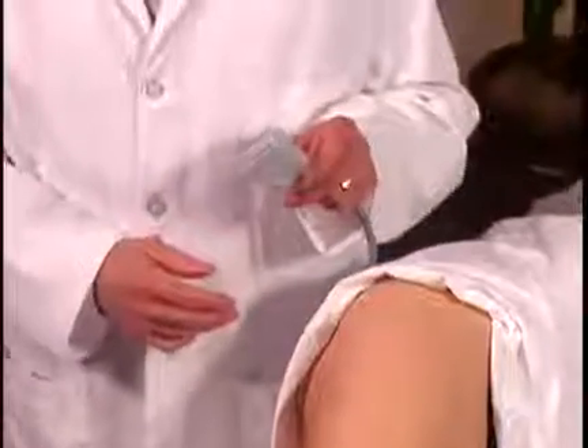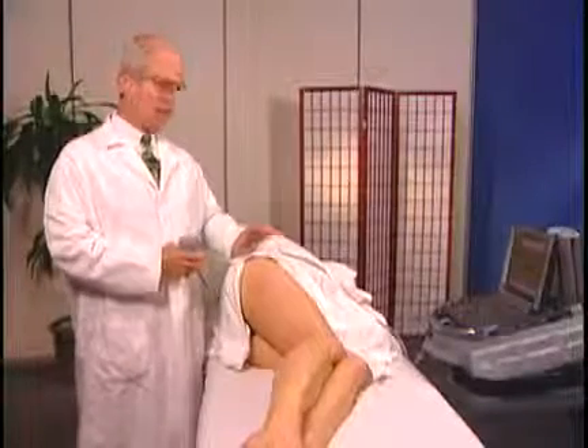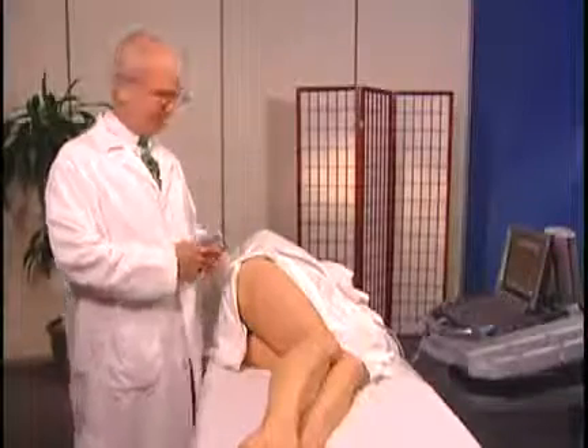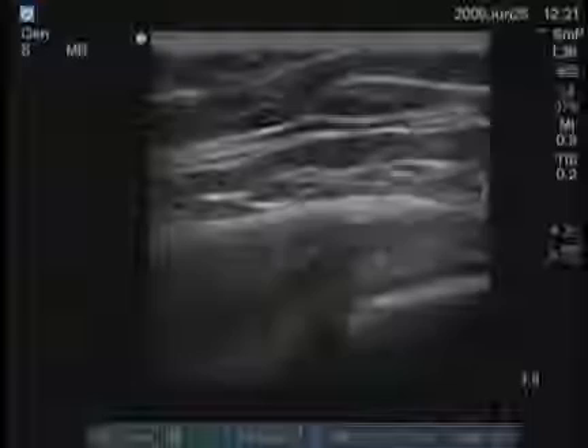I'm using a linear transducer now. Sometimes in a person who has a much deeper area to traverse, we might use a C60. This transducer has a linear mark here which corresponds to the turquoise dot on the screen, and we keep that proximal, or we keep that medial.